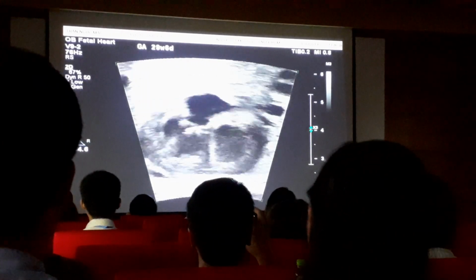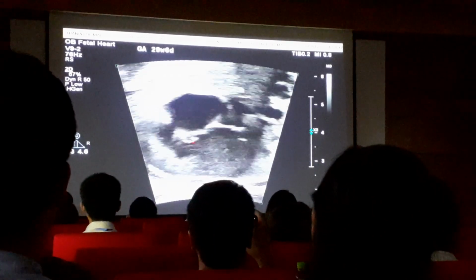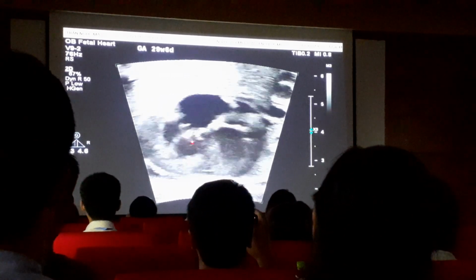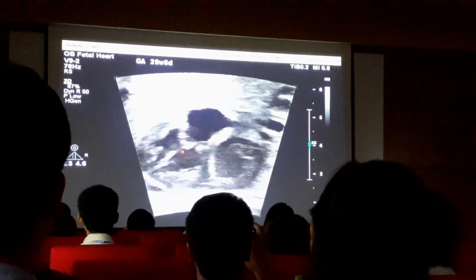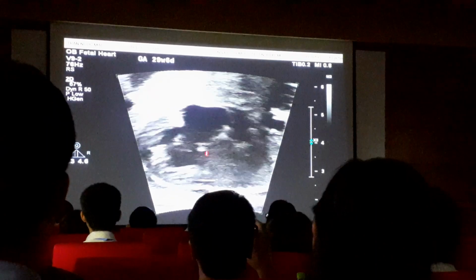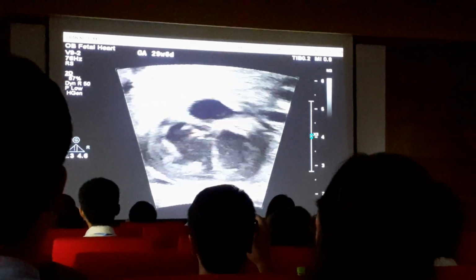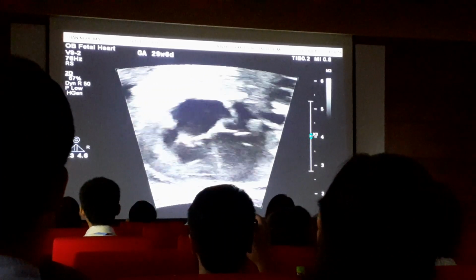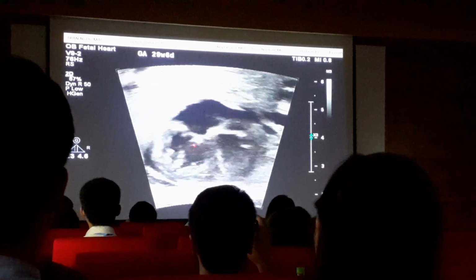And I think that when I appropriately use the zoom and res features, we can really see the fine detail of the tricuspid valve here, which is starting to look very dysplastic. Mình thấy là khi mình dùng zoom cũng như là cái độ phân giải tốt thì chúng ta có thể thấy rõ ràng cái cấu trúc của cái vành lá nó có vẻ nó bị loạn sản ở phía này.